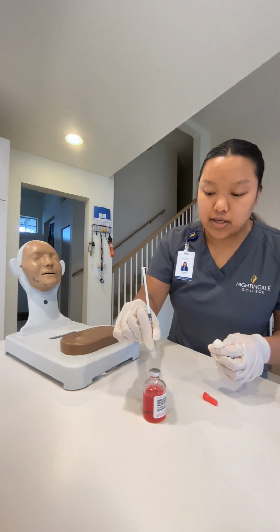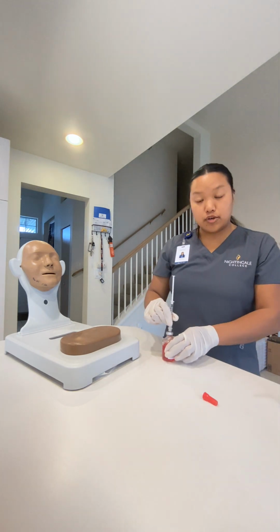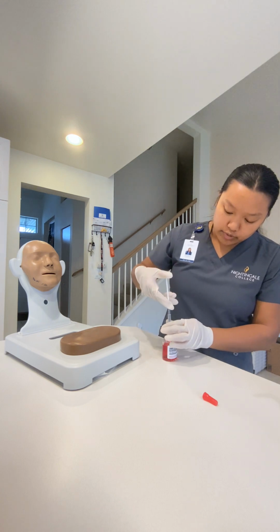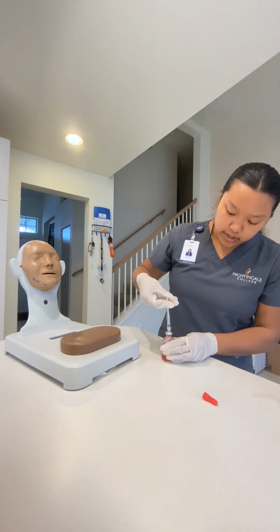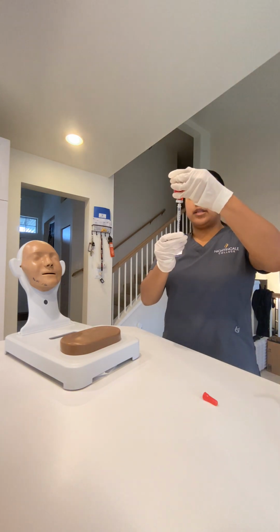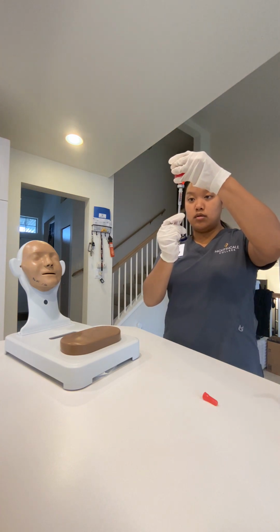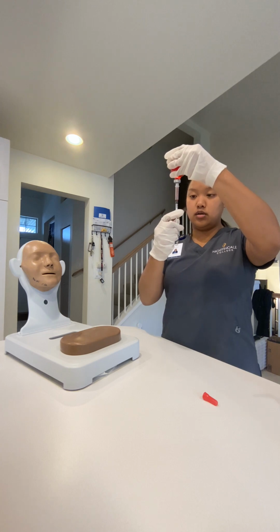So now I'm gonna go ahead and inject into the vial, just like that, on a flat surface. And now what we're gonna do is, we're gonna go ahead and inject the air. 1 mL of air, there you go. Now we're gonna invert. Then we're gonna get our 1 mL of solution here.